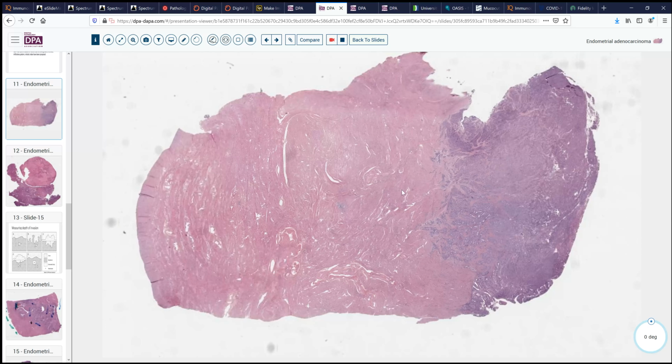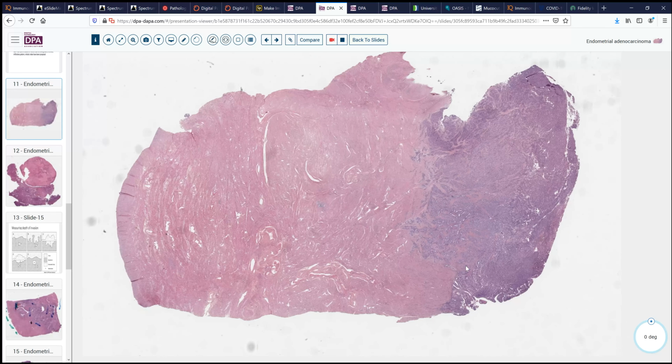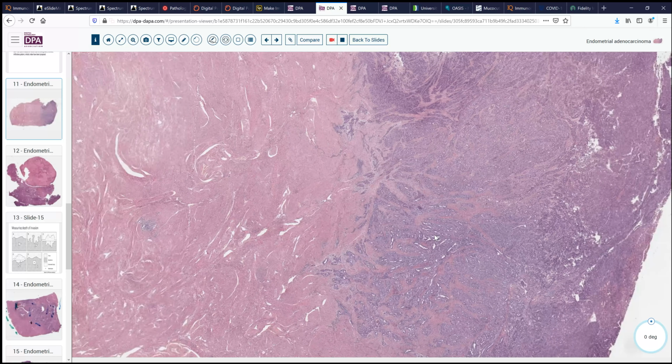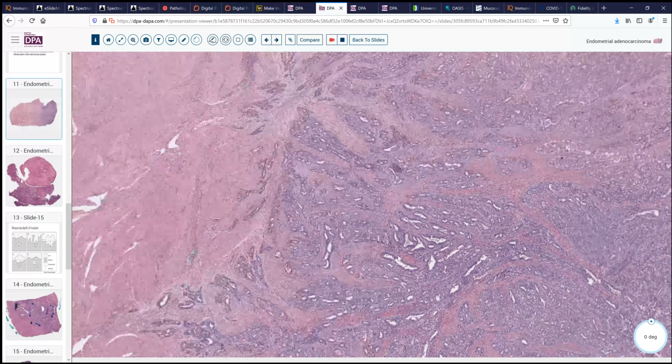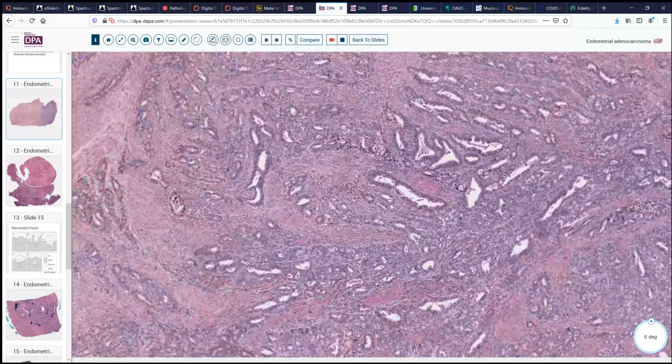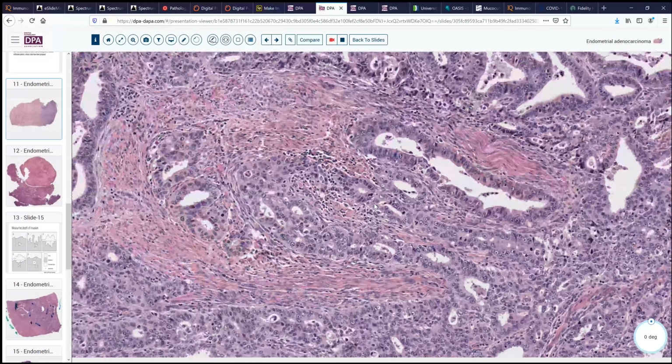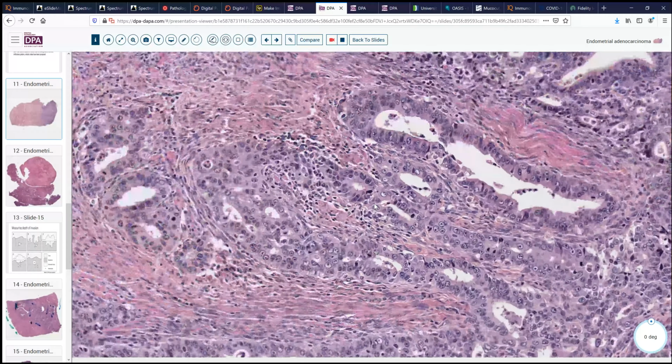So here's a tumor at low magnification. We can see that it appears to be invasive of the myometrium, and there's a lot of blue in this tumor. It's got a little bit of open spacing here. We can see some formed glands. And so we can begin to look at this and evaluate this. And this is one of these tumors that is difficult for many people to classify, because when they come to high magnification, they may look and say, well, there's a gland, here's a gland, here's a gland. This is all glandular tissue. There's not solid growth. But in reality, this is solid growth here.